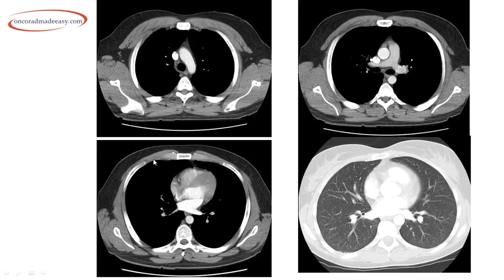On serial CT sections, the first three are soft tissue or mediastinal window images and the last is the lung window image. On mediastinal window you look for cardiovascular pathologies, lymph nodal pathologies, mediastinal pathologies, or chest wall pathologies. Structures visible include the aortic arch, superior vena cava, trachea, ascending and descending aorta, main pulmonary artery, right and left pulmonary branches, left atrium, right ventricle, and left ventricle. On lung window we look for lung parenchymal diseases like interstitial, alveolar, or bronchial pathologies.